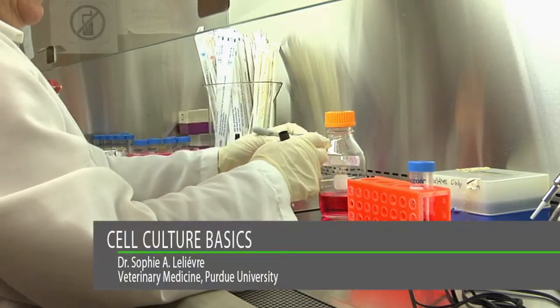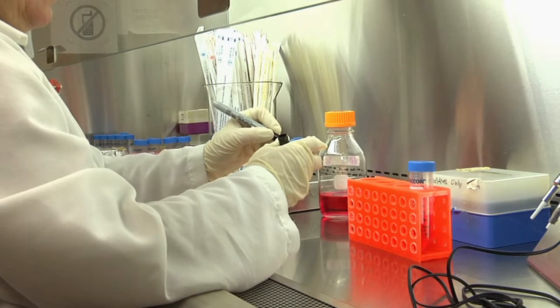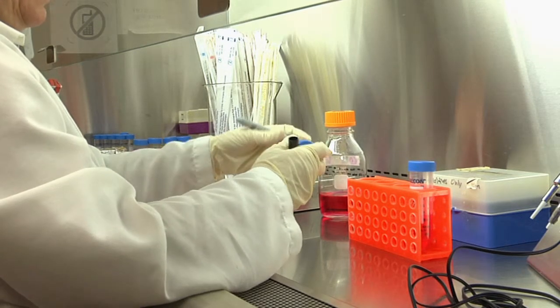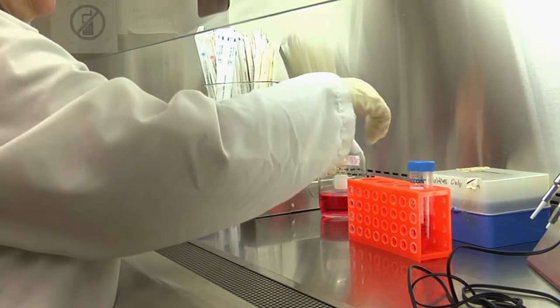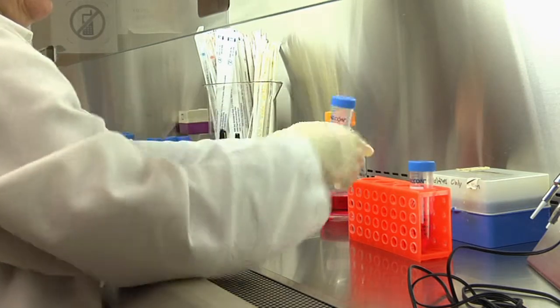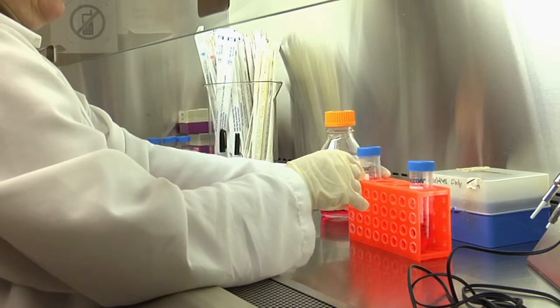Remember to label any container before you add the liquid. This will prevent the liquid from touching the lid when you manipulate the container to write on it. Open the lid and place it back on top of the container so that it is easy to lift when you are ready to add the sterile liquid, like the cell culture medium, for instance.